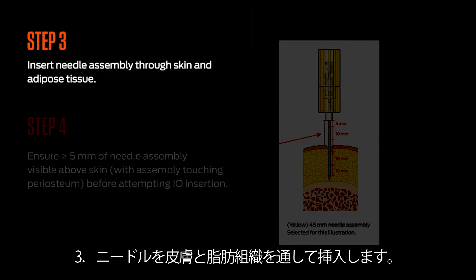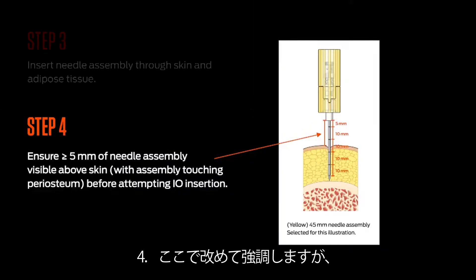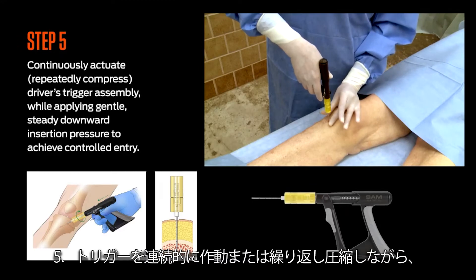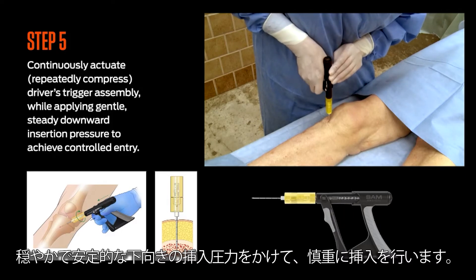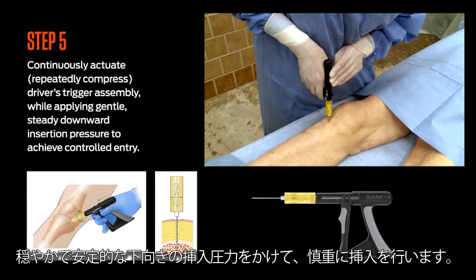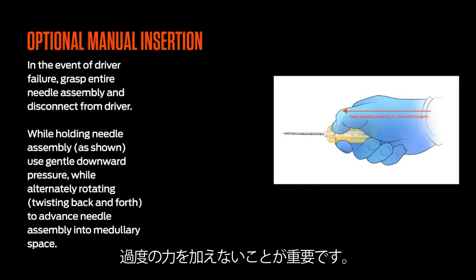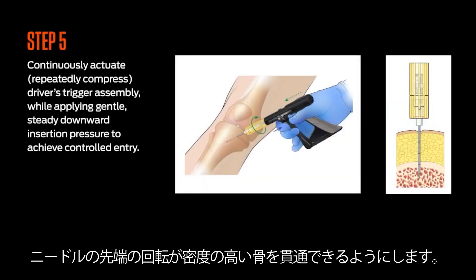Step 3: Insert the needle assembly through the skin and adipose tissue. Needle assembly selection is based upon overlying tissue depth at the insertion site. Step 5: Continuously actuate or repeatedly compress the driver's trigger assembly while applying gentle, steady, downward insertion pressure to achieve controlled entry. Do not use excessive force — use minimal, gentle downward insertion pressure, allowing the needle assembly tip's rotation to penetrate the compact bone.